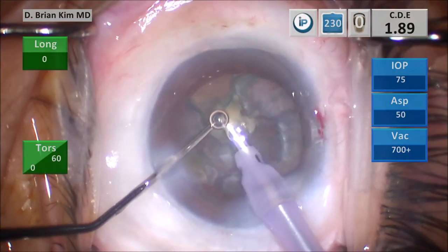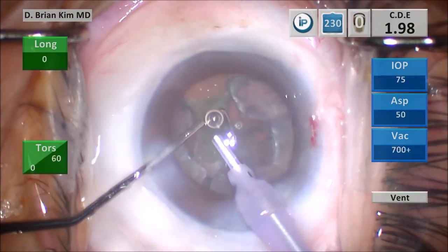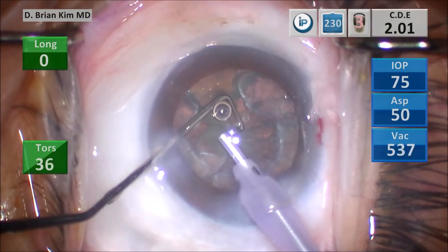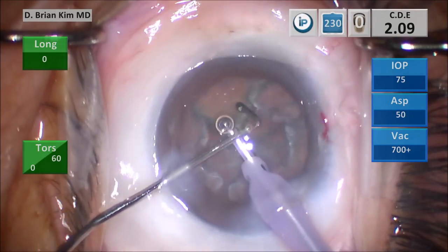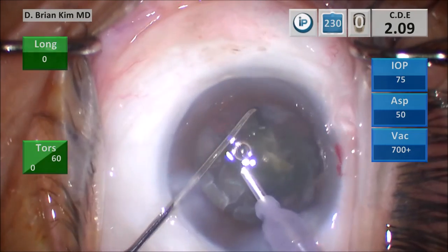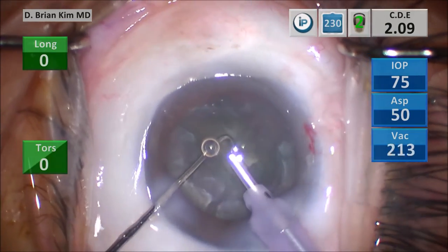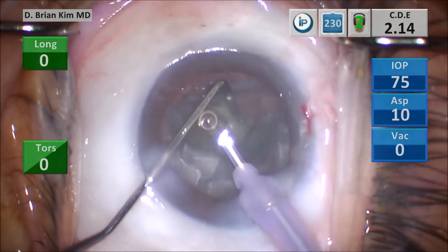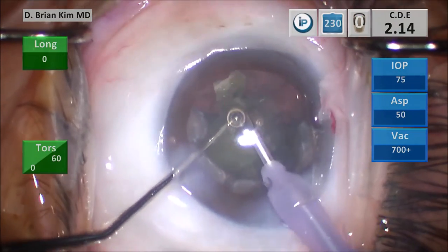This is the final little piece. I'm making sure the chopper is definitely underneath the epinuclear ridge. I pull that lens piece out of the capsular fornix and now it's in the middle of the bag and I'm able to manipulate it. I'm manipulating the lens piece so I can crush it between the chopper and the phaco tip. As the piece becomes smaller, I use high vacuum to emulsify the lens piece and a little bit of ultrasonic energy.